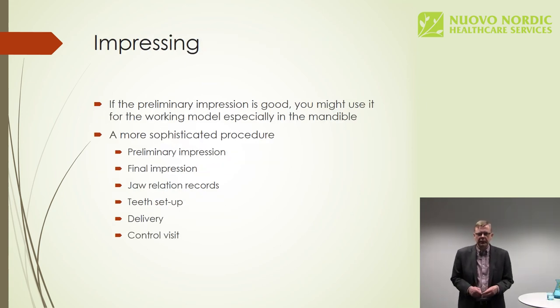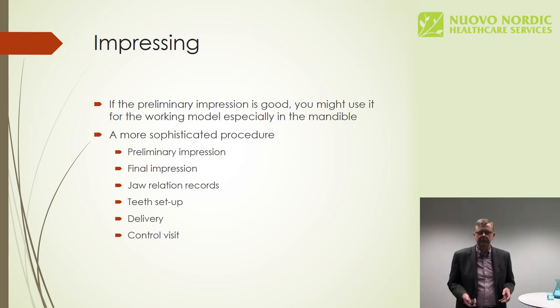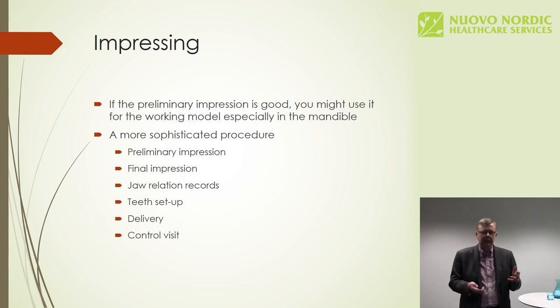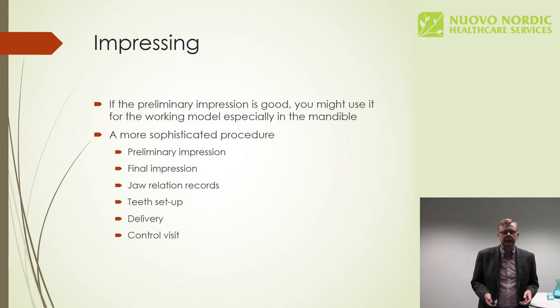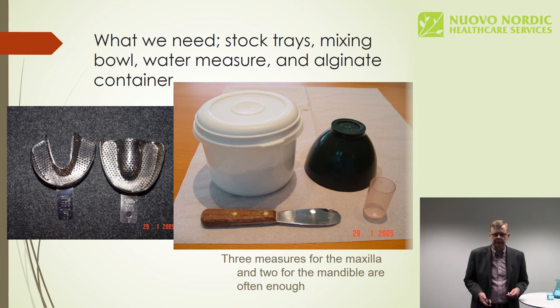So, we'll go into the impression first. As I mentioned, for the final model, for the working cast, we will use an alginate impression in the mandible. In the maxilla, we'll take an impression with polyvinyl and a border molded custom tray. Anyway, otherwise this sequencing of the fabrication will follow the common setup of a denture fabrication.